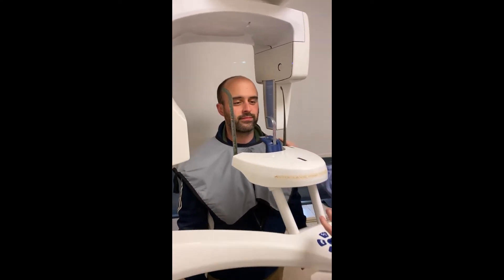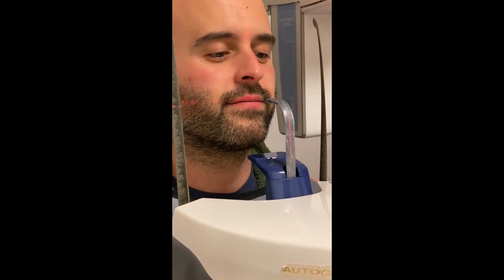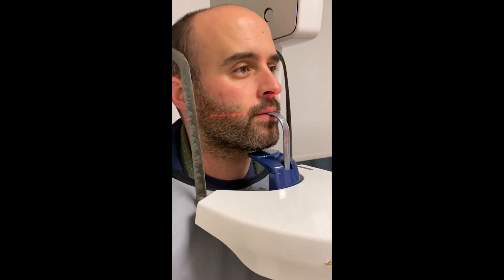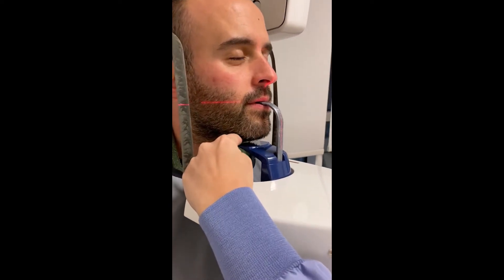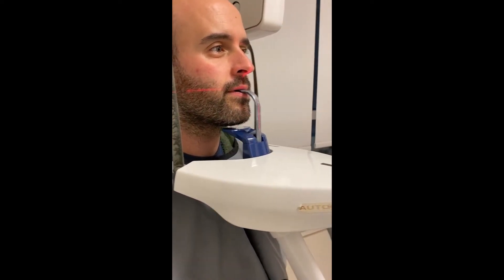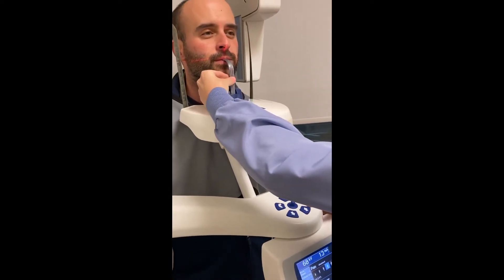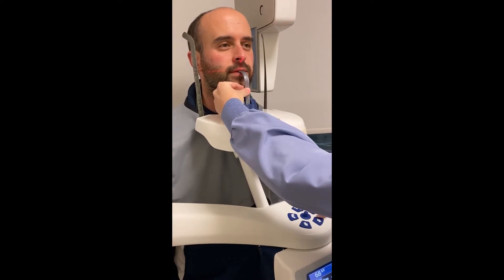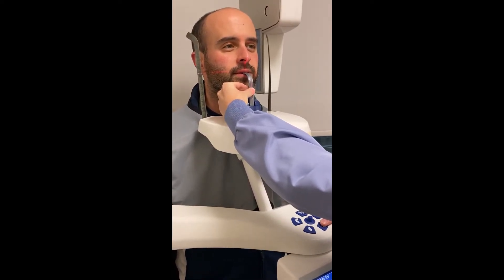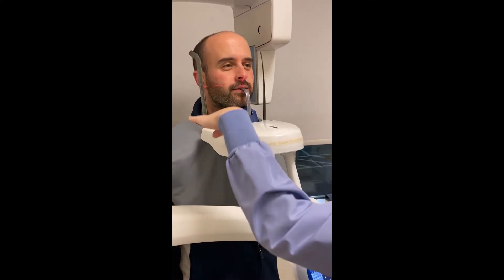Go ahead and step forward. On this bite stick, there is a notch on the top and a notch on the bottom — have the patient bite their two front teeth onto that notch. There will be a small gap between the chin rest and the patient's chin. Press the up arrow on the keypad and slide the bite stick down while raising the pan up, which helps keep the chin nice and parallel to the ground.